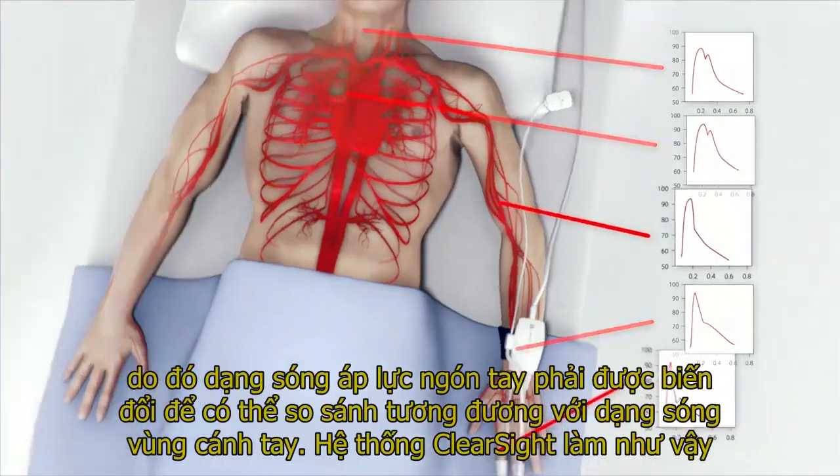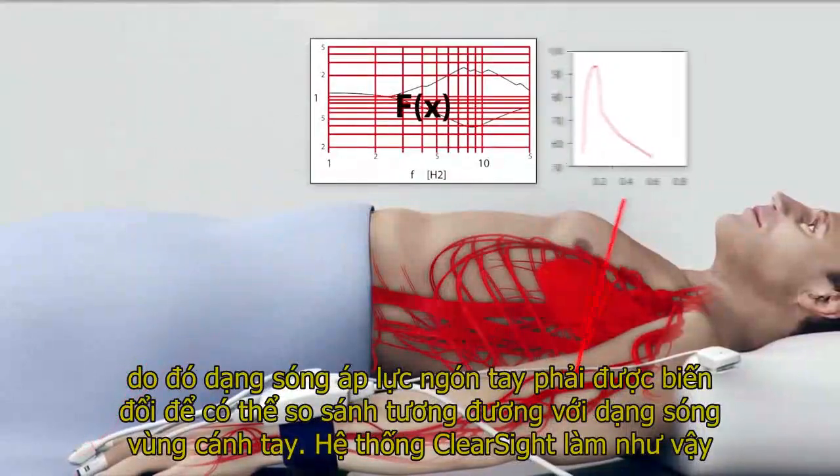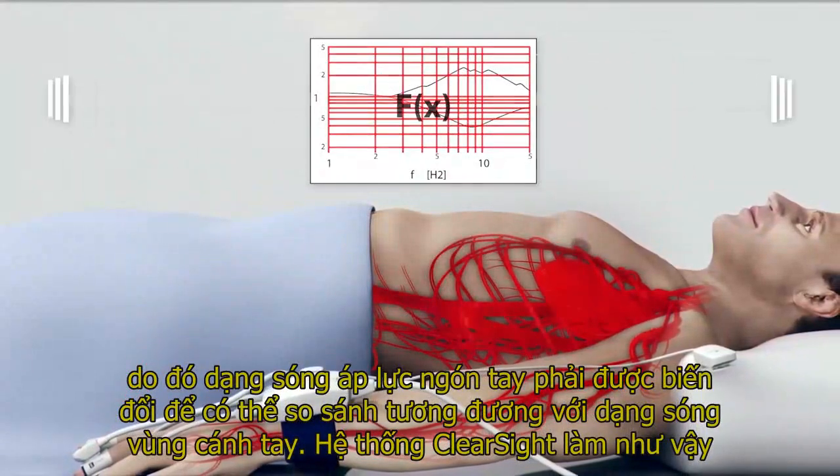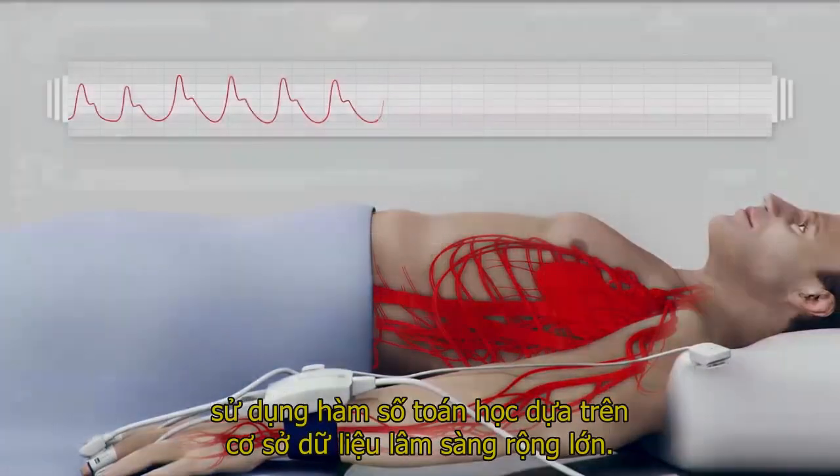Therefore, the finger pressure waveform must be transformed to be comparable to a brachial site waveform. The ClearSight system does so using a mathematical transfer function based on a vast clinical database.